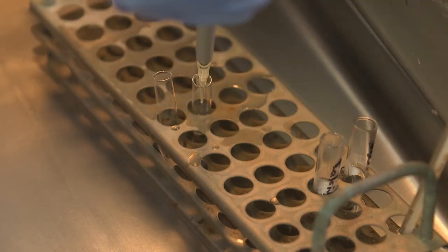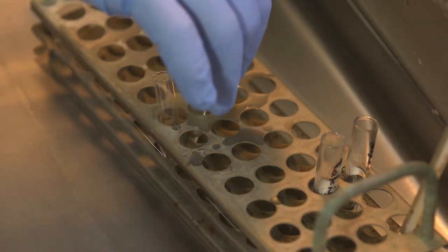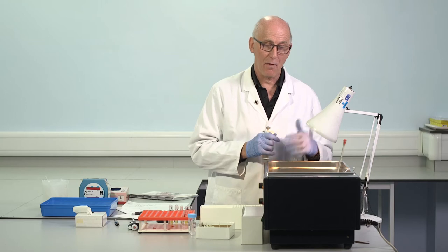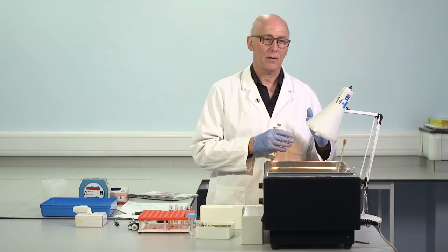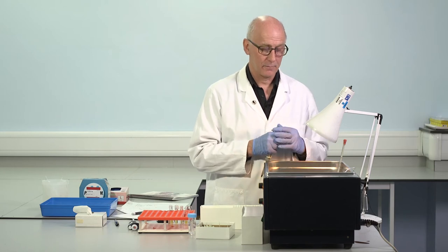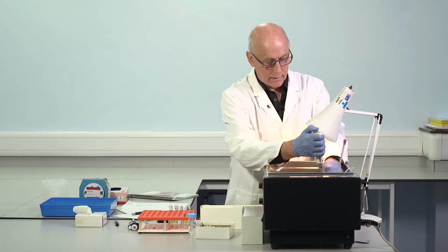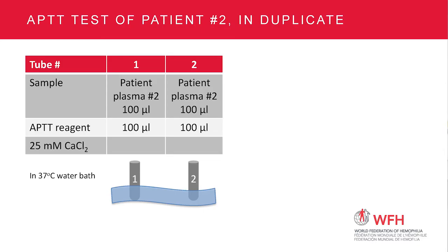APTT reagent to the first tube and mix. Activation, contact activation. Essentially no calcium present. Remember the sample we'll talk about in a moment. Citrated plasma, very little calcium. The citrate removes the calcium, as you know. APTT reagent to the second tube. So whilst that's incubating, reference range.